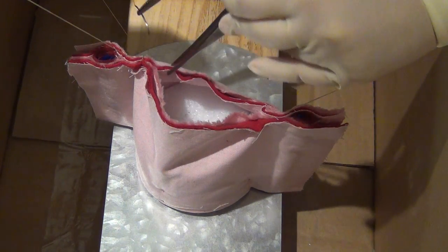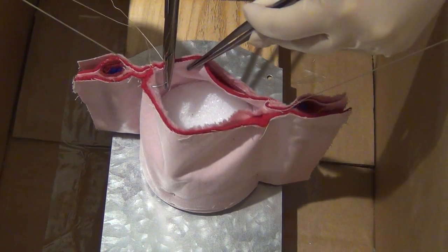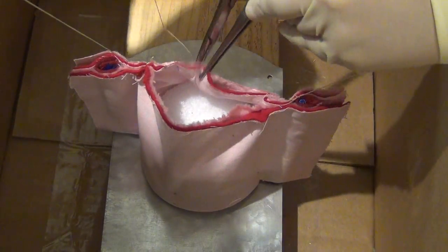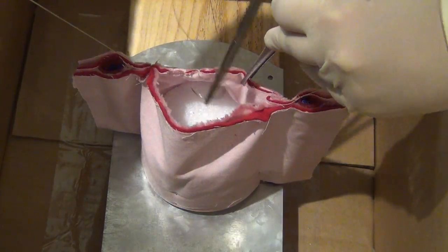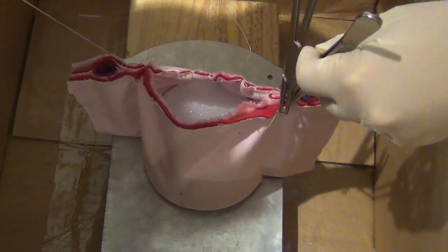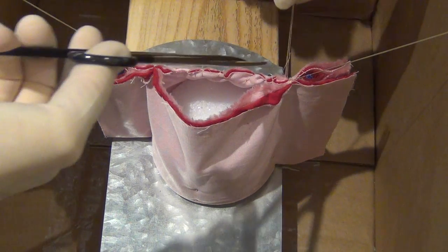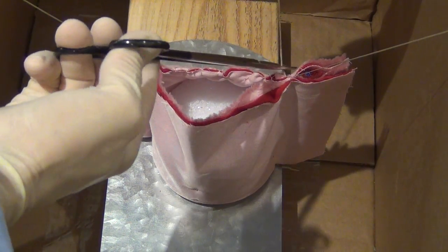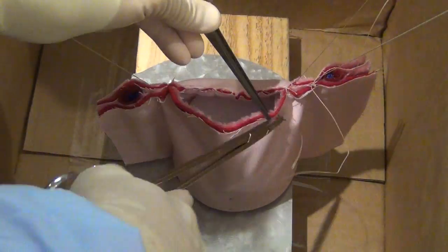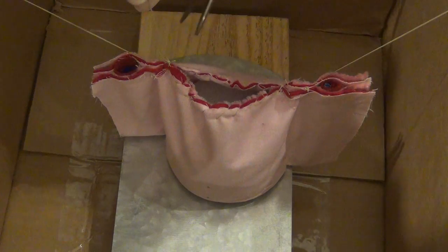This is done by grasping the anterior portion of the vagina and placing the stitch from the peritonealized surface through the vaginal epithelium. This suture is then run in a similar fashion without locking, sealing off the peritonealized surface and the vaginal epithelium and tying off any vessels that might bleed from this area. Once the other angle is reached, the suture is then tied down and cut. A similar procedure can be repeated for the posterior aspect of the cuff, again with a running non-lock stitch, tying down at both angles and cutting the suture free.